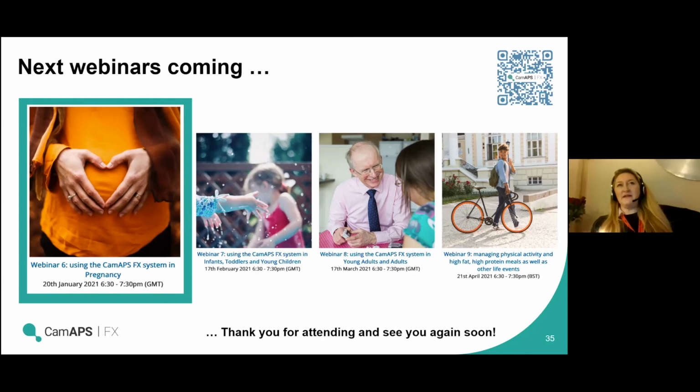Yeah, absolutely. This is the time where you're going to be turning the phone on its side and looking to see what's been going on. If it's very close to a meal bolus and you're really plummeting, you might be thinking, I wonder if I got my carbs right there, or I've not absorbed this very well, and there's a lot of insulin here that I'm going to still have active. If I just wait to see, with two straight down arrows, you'll end up hypo.